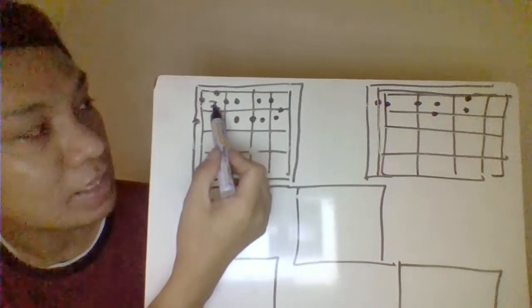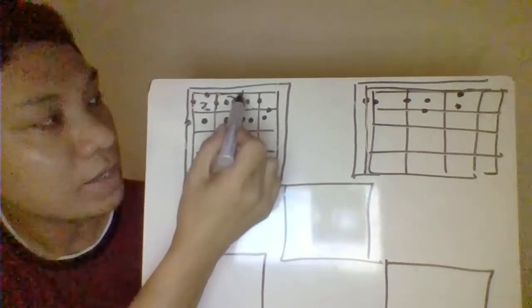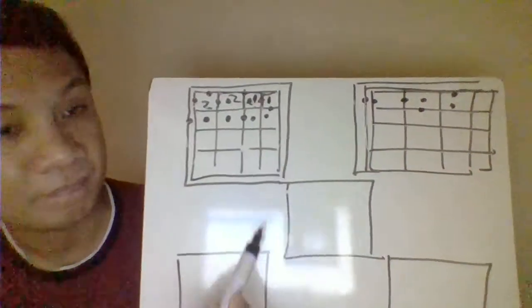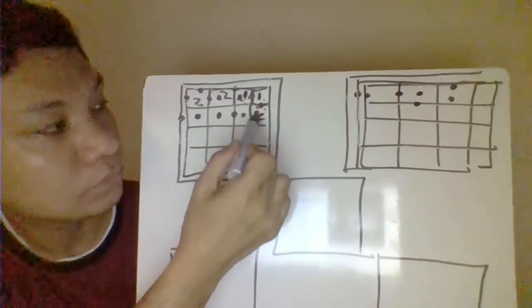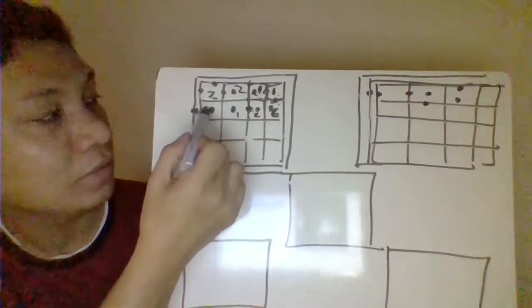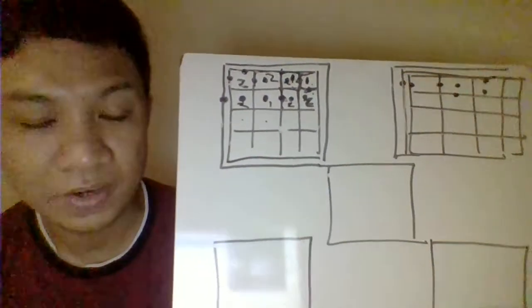Nakita mo dito may hindi na siya part dito. Okay, so dito mo na siya i-count. This one, 1, 2, 2 pa din dito sa next. Okay, dito naman, hindi mo na bibilangin ito kasi ulit ang boundary natin? Ito lang, saka ito lang dapat. Dito na square, so ito ang ating boundary, saka itong boundary. So, meaning to say, ito ay hindi na part dito. So, this is 1. Ito naman, since dito siya, so ito ay dito sa kanya, so 1 pa din siya. So, pababa ka na, dito. Okay, ulit ang ating boundary ay ito, saka ito. So, bilang mo ito, saka ito, that's 2. Okay, dito ulit, ito ang ating boundary, saka ito. So, since meron ka dito, saka dito, that's 2. 1. Okay, dito. So, meron tayong dito, this will give you, counted pa rin siya dito. That's still 2. Mean to say, kakount mo to lahat, isa-isa. Okay? So, lipat ka dito in all, until all the 5 na squares, you have already counted.